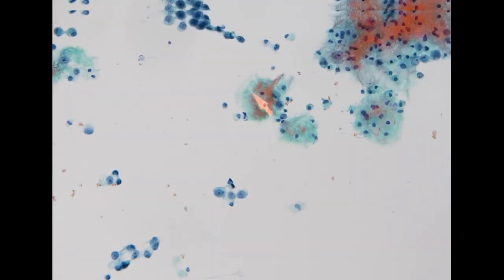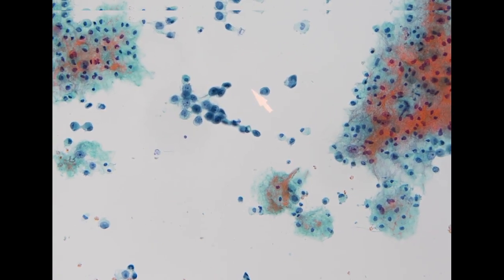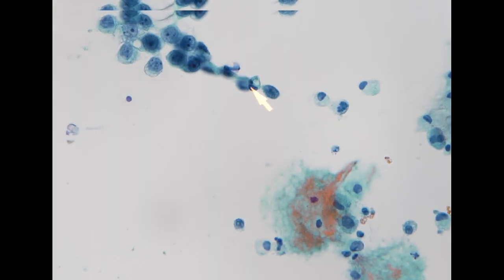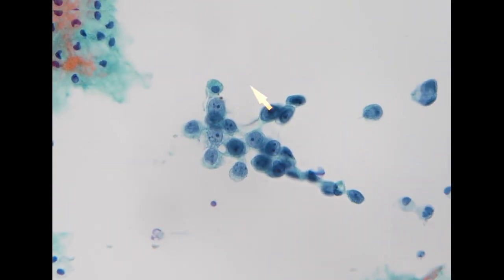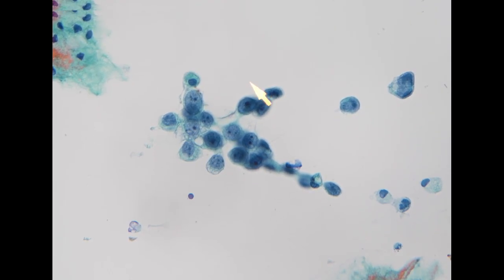So low power feature is very important. We rely on the low power feature to generate our initial round of differential diagnoses. And when we go to higher power, again, these cells do show typical morphological features of adenocarcinoma. So we have big nuclei, the chromatin pattern is vesicular, and we do see prominent nucleoli.